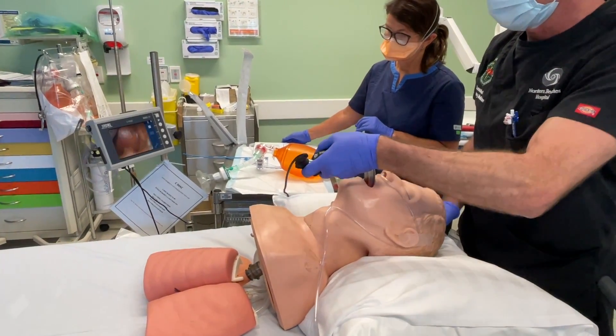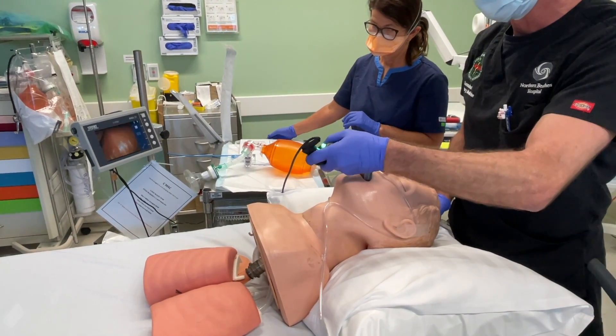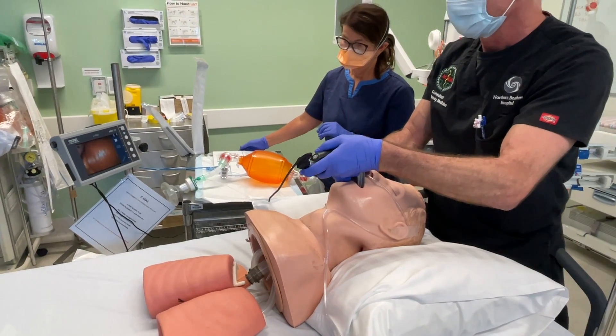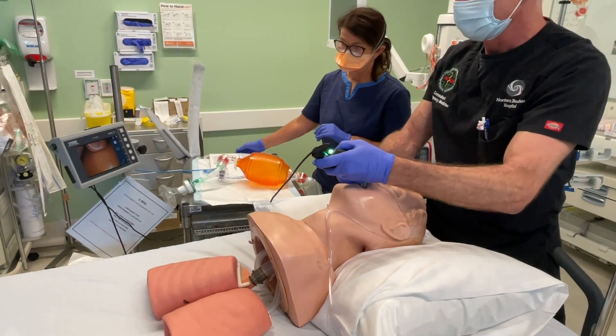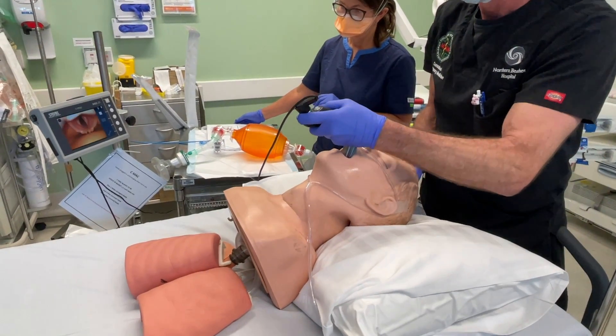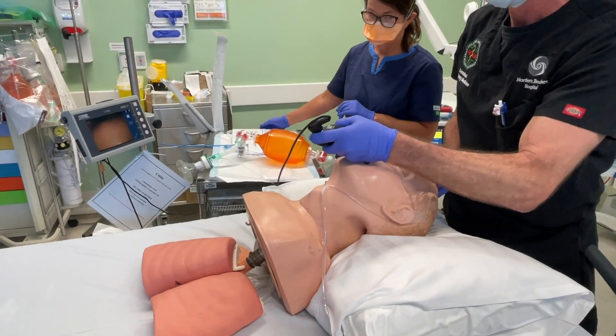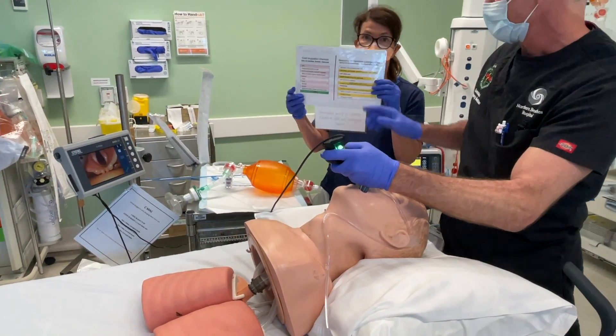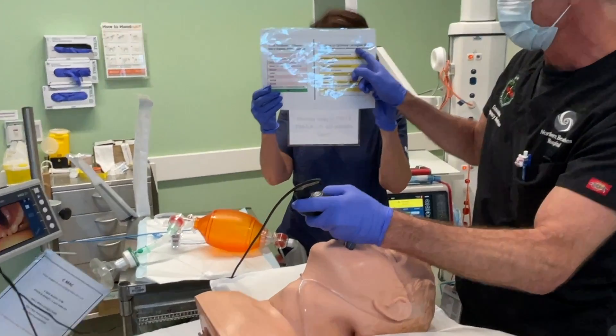Just to summarise: if we don't get an adequate view on initial laryngoscopy, despite our initial attempts at optimal positioning and full paralysis, I'm going to do external laryngeal manipulation, I'm going to lift the head more, I'm going to insert all the way, lift, and come back. Those are our basic drills to optimise our view of laryngoscopy and our sequence to optimise laryngeal view. Thank you.